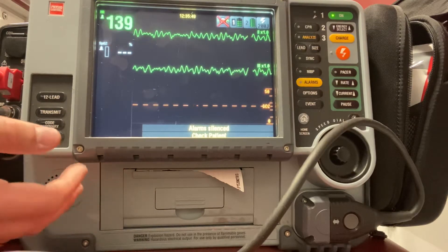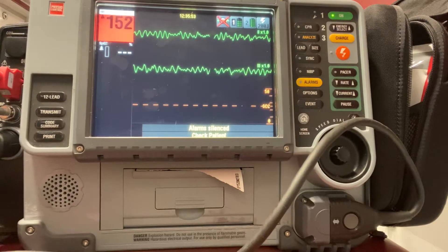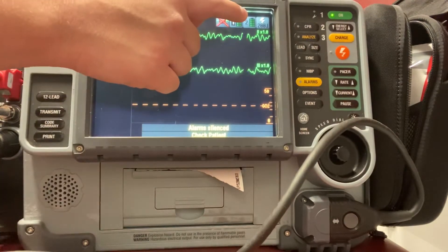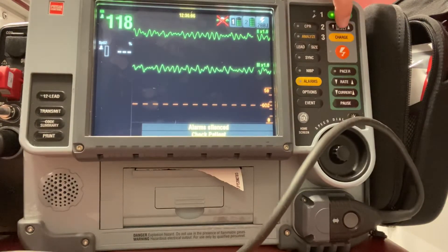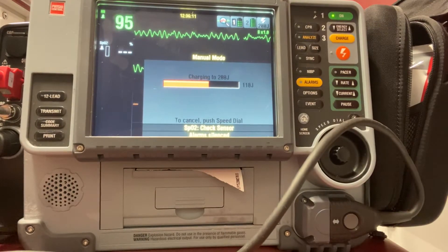So for this LifePak 15, the manufacturer recommendation is that I defib at 200, 300, and then 360. For this monitor, it's automatically going to charge 200 — I can see up there in the corner it says 200. So I can skip my energy select and just go ahead and go straight to charge, which allows me to do this faster.